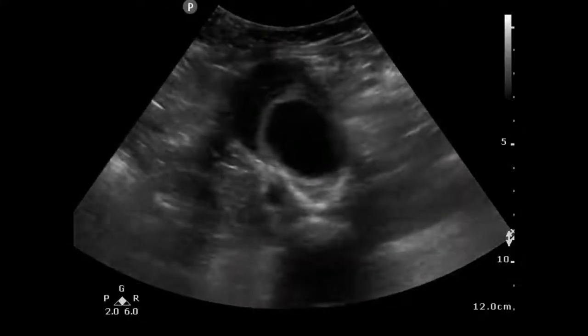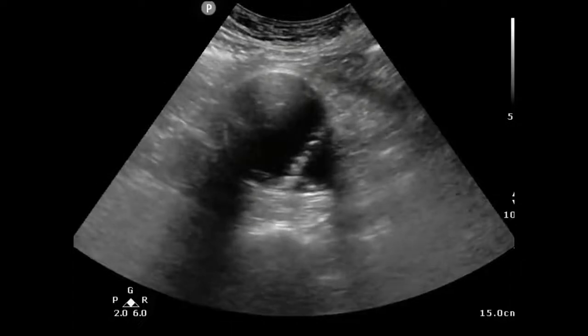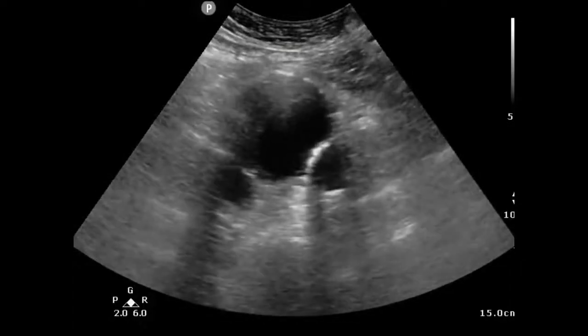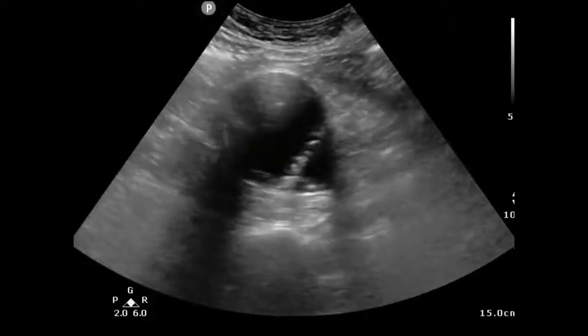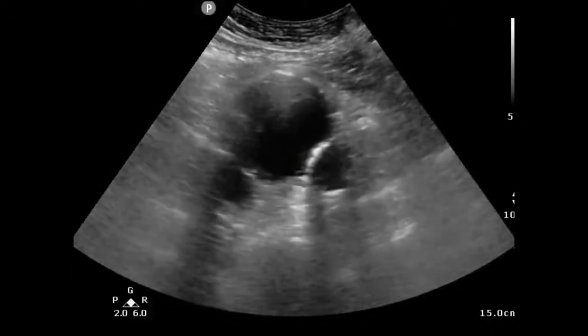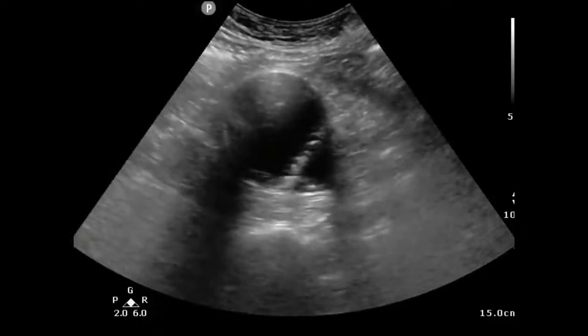Here's another image of a saccular aneurysm. Another thing we can detect with ultrasound but are not really good at is a dissection. It's a specific test but not sensitive, which means that if you see a dissection, you have a dissection — but if you don't see a dissection, it doesn't mean that you don't have one.